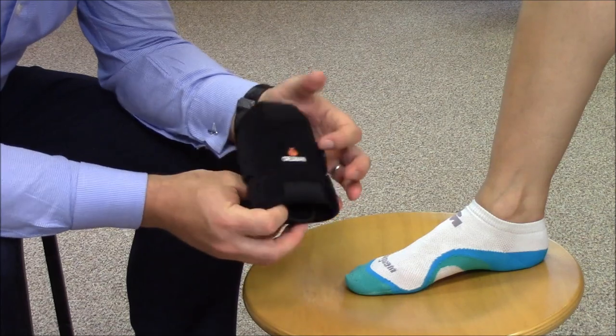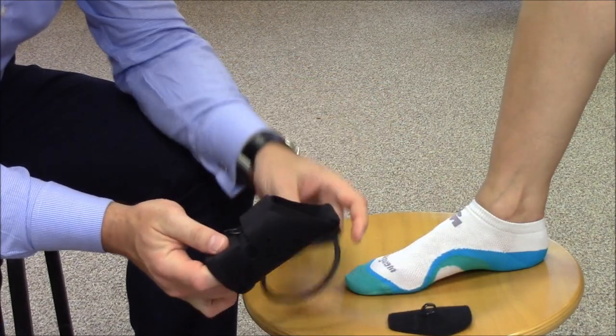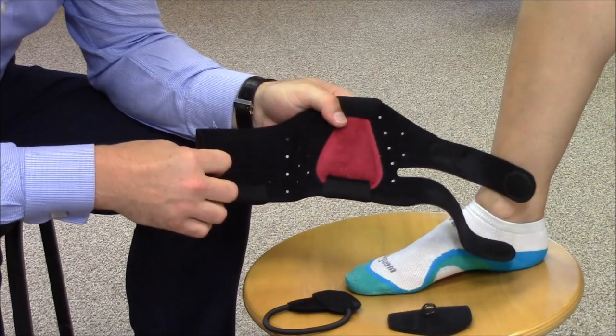Begin the donning process by wrapping the perforated ankle support around the ankle with the interior gel padding situated at the Achilles tendon. This can be seen on screen as the red padded section.